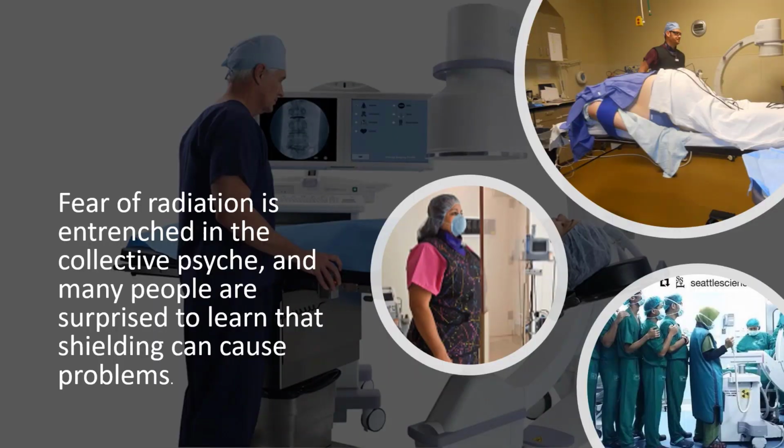Radiophobia. Until the last few years, people didn't really look at radiation in its true perspective of low ionizing radiation being applied. So again, they told you the best place to stand when doing fluoroscopy is behind the physician, because that will give you an extra shield. So you can see here how we have everybody lined up so the person in front of them is getting the brunt of the radiation that's being transmitted. Or we have some portable shields that are in the emergency room to stand behind, and notice that the nurse has a lead vest, a thyroid shield, and is standing behind the portable shield.